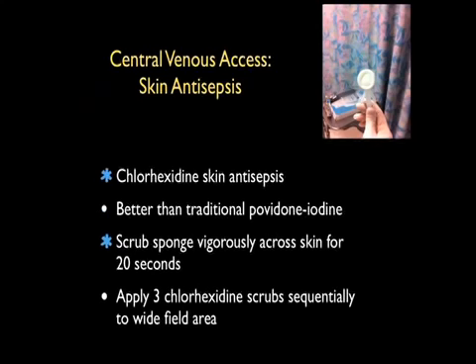The second step for decreasing the complication rate of central venous access is adequate attention to skin antisepsis. For this initiative, chlorhexidine is going to be optimal.